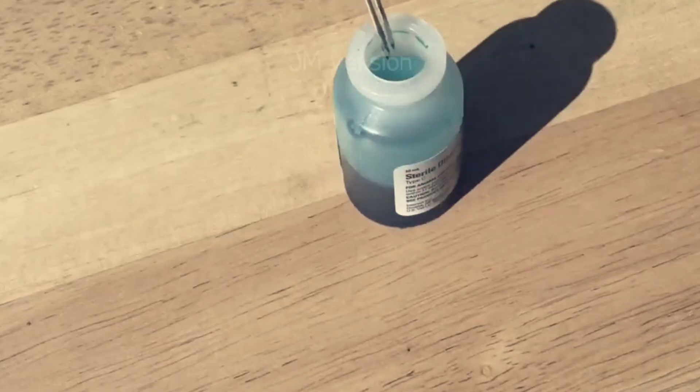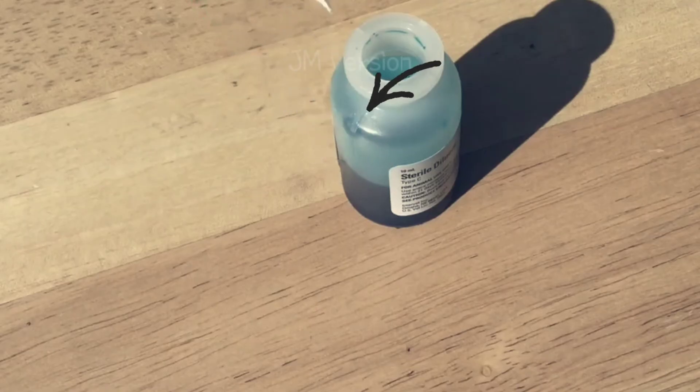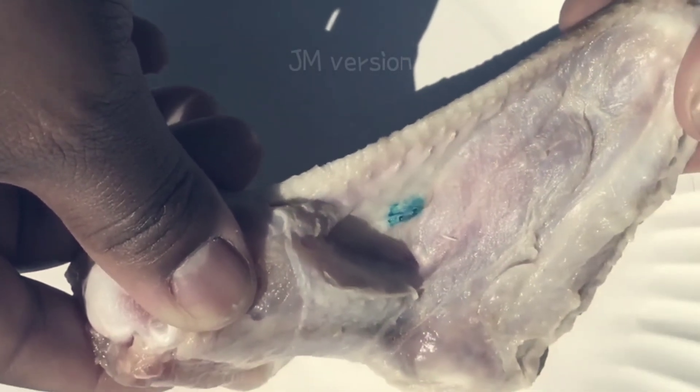When you dip the applicator stick into the vaccine bottle and pull it out, you will see that the grooves are filled with the vaccine. The blue dye left behind on the skin surface allows you to see which of your chickens have already been vaccinated.